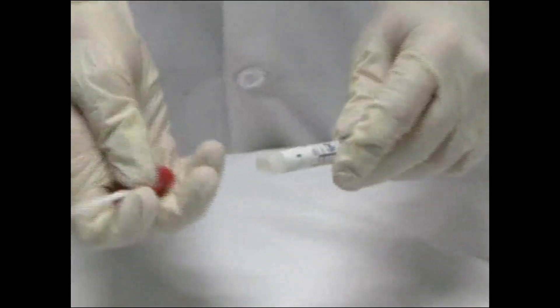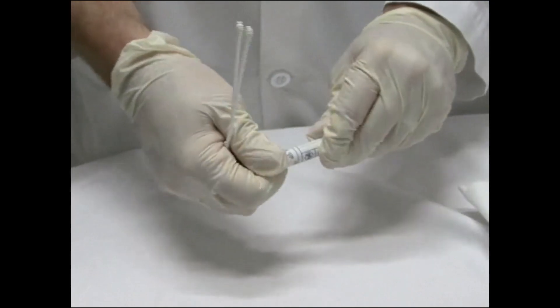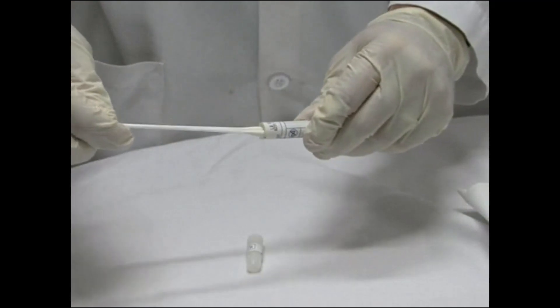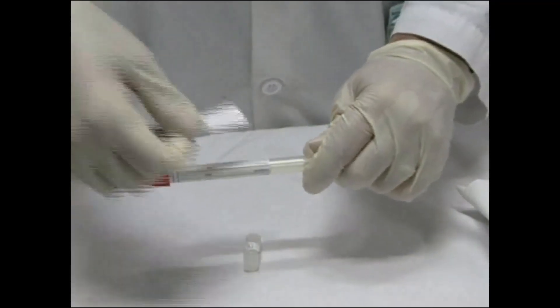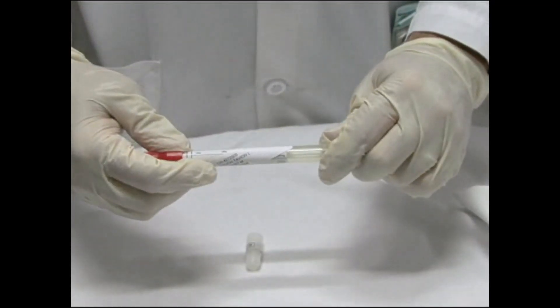Once the specimen has been collected, place the swabs in the transport tube. Label immediately and send to the lab for rapid strep test and/or culture as soon as possible. For kit use or culture plating, follow the instructions and/or the recommendations of your laboratory.